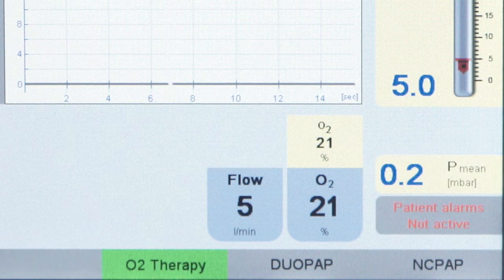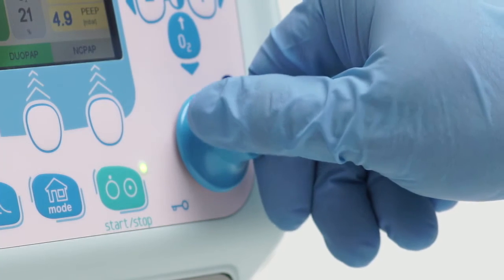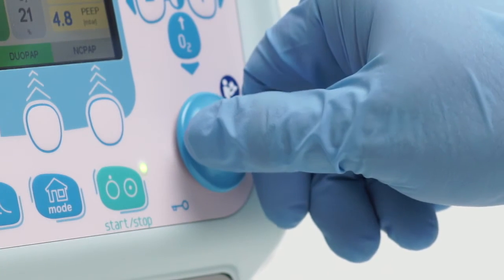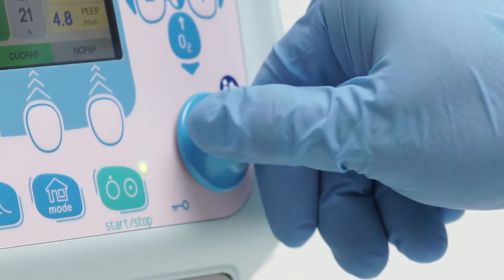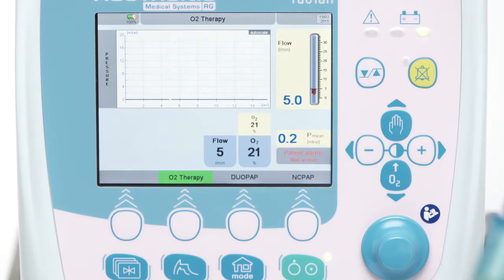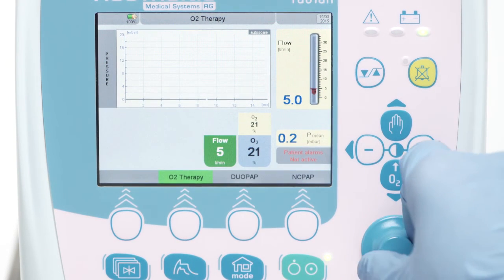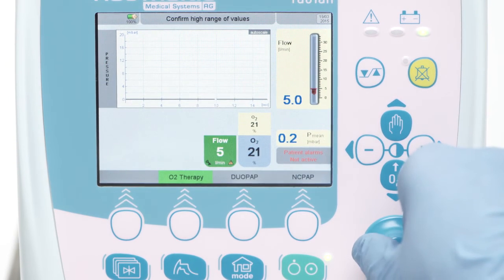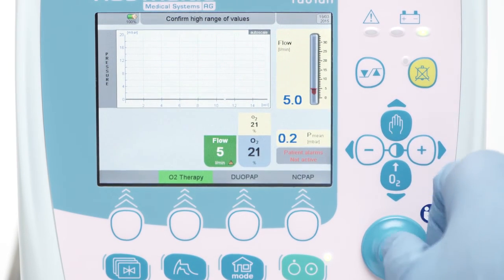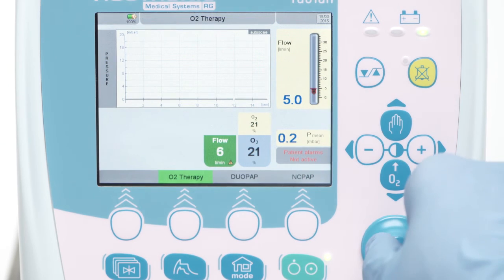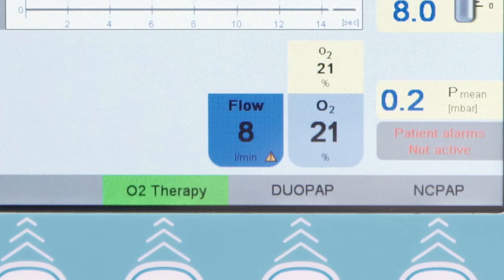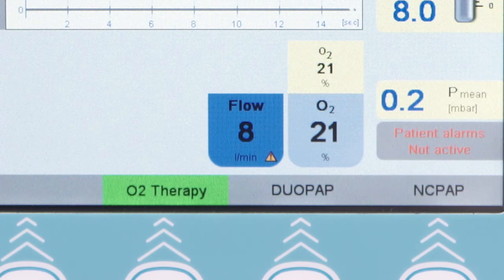To override it, press the rotary knob and set a higher flow. The maximum setting is 15 liters per minute. Then confirm. If the flow setting is in the override range, a small warning triangle remains inside the flow button.